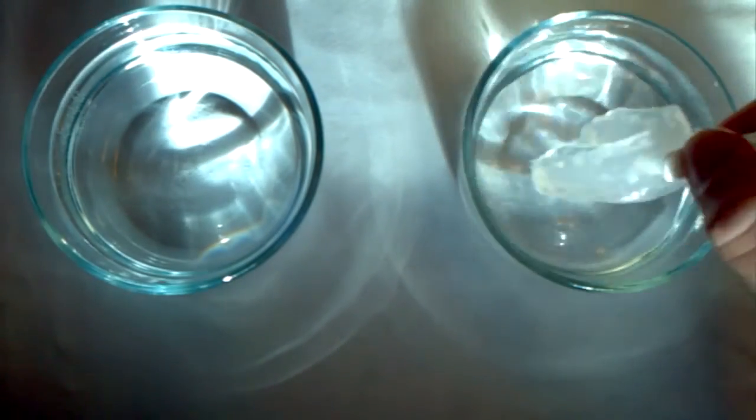Okay, I just finished with the fitting process. Everything went exactly as I was talking about. I didn't have any issues as far as completing the process. It took about 5 minutes. Pretty simple. I've had the mouthpiece in the cold water now for about a minute, so I'm going to go ahead and take it out and see what it looks like.